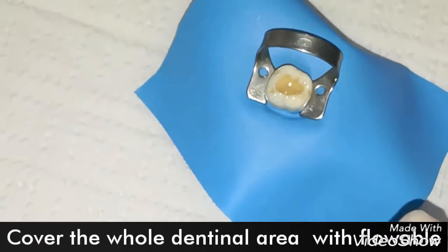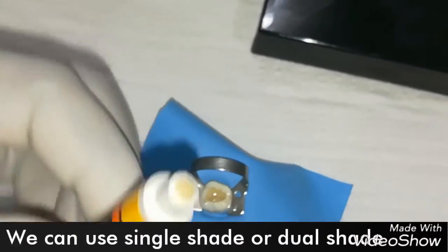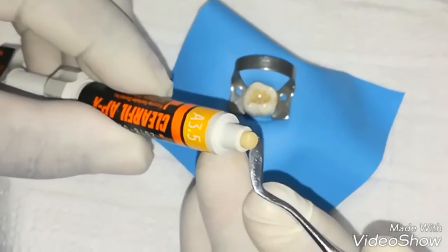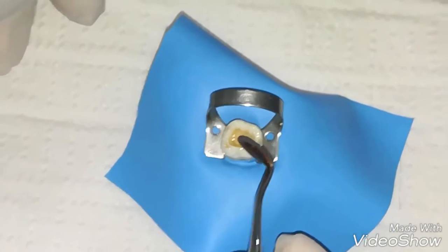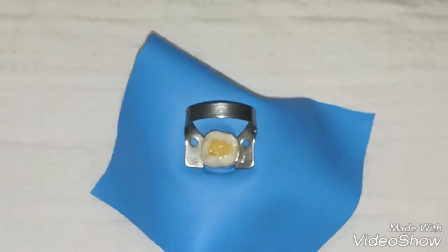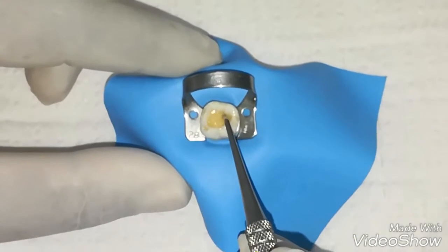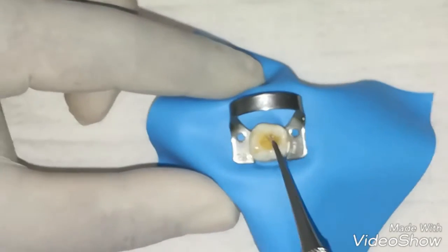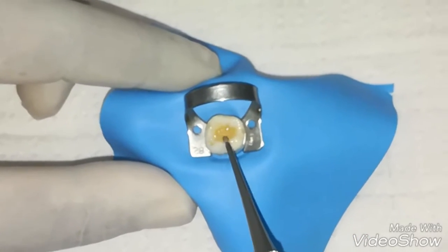Now we are going to put heated packable composite over it. We are going to use the heated packable composite and just put a little bit on top of the bond and flowable. Simply push it downwards. We can see the flowable coming out from under the packable pressure from within the cavity.